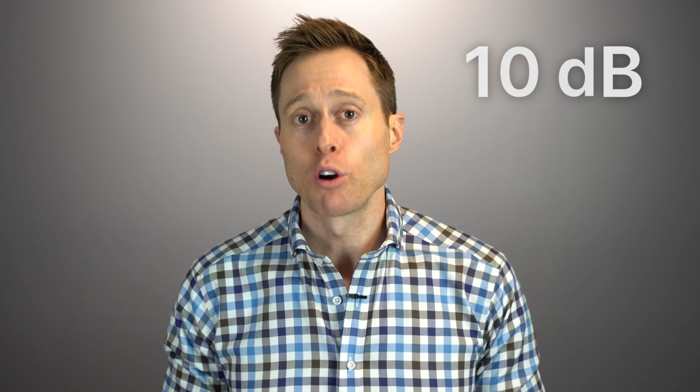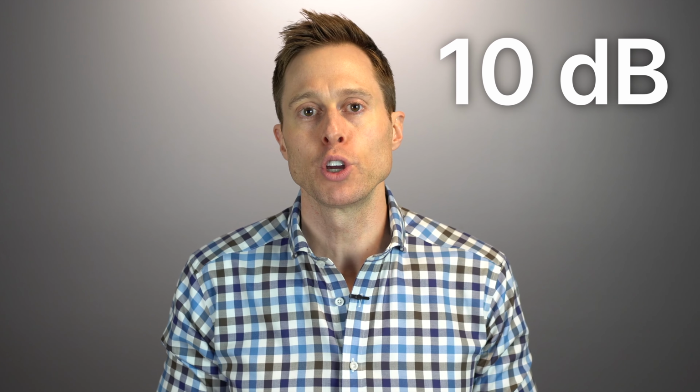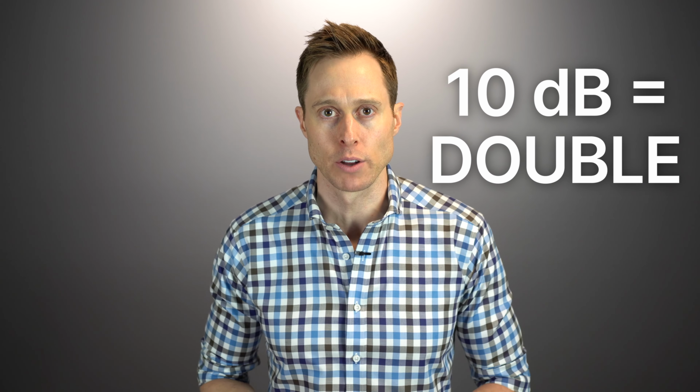So if you have an SNR loss score of 10 decibels, that means that you need a 10 decibel separation of the speech from the background noise before you can understand 50% of it. And just so you're aware, a 10 decibel separation in signal-to-noise ratio means that speech has to be twice as loud as the background noise. So when using directional microphones, the goal is to get that signal-to-noise ratio loss score to be as low as possible. So the better directionality that you have, the more you improve it. And if you can improve it by enough, you could actually hear the person talking to you in background noise.